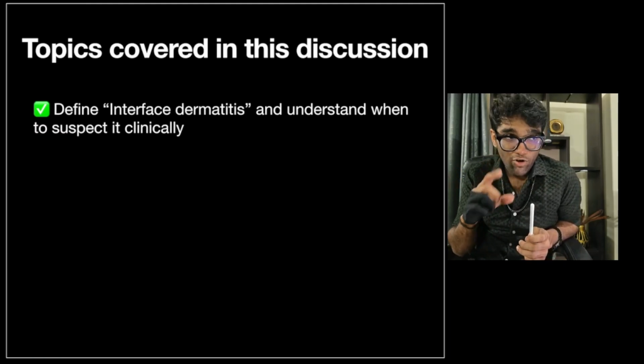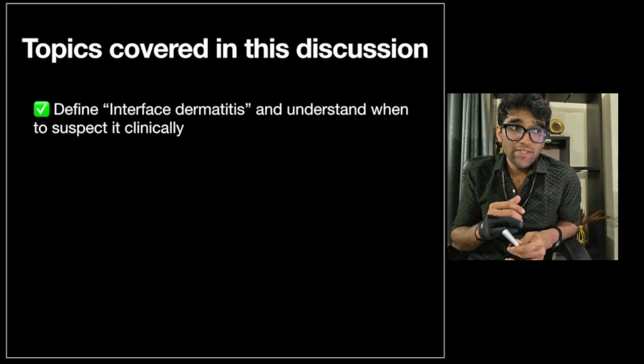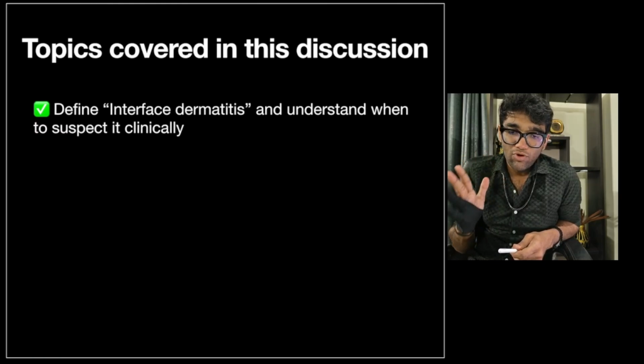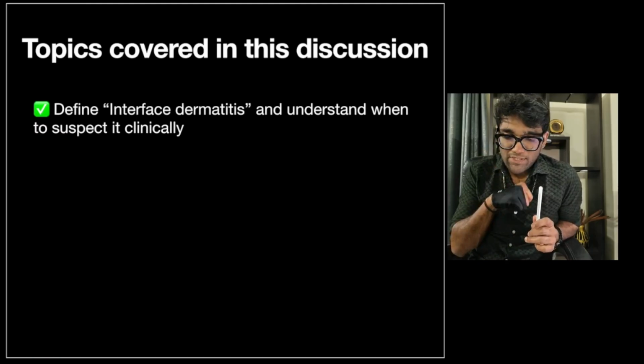If you see a lichenoid infiltrate in the superficial dermis, that would then be a lichenoid interface dermatitis. And we've understood that well demarcated lesions without significant lichenification, or lesions that show epidermal thinning, would constitute lesions that could be interface dermatitis.